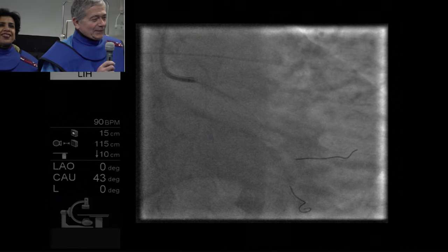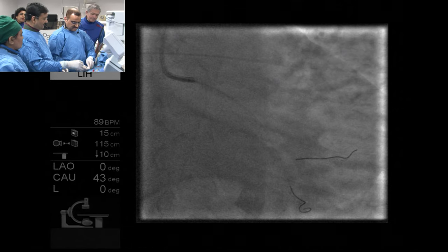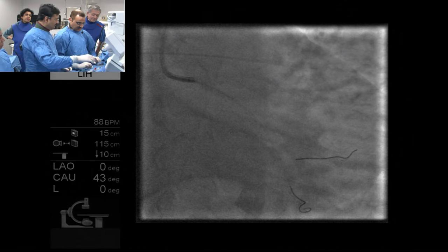It's very good. So this is my Indian way, poor man's technique, to keep the wires separate. We have two wires and I put this gauze so it doesn't crisscross at all. Very good.